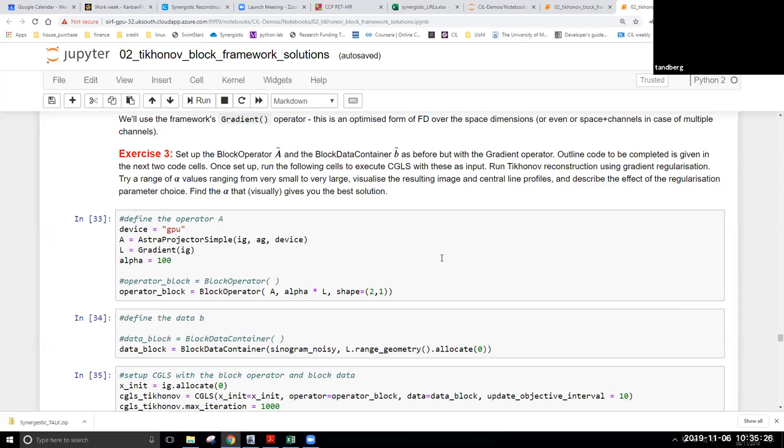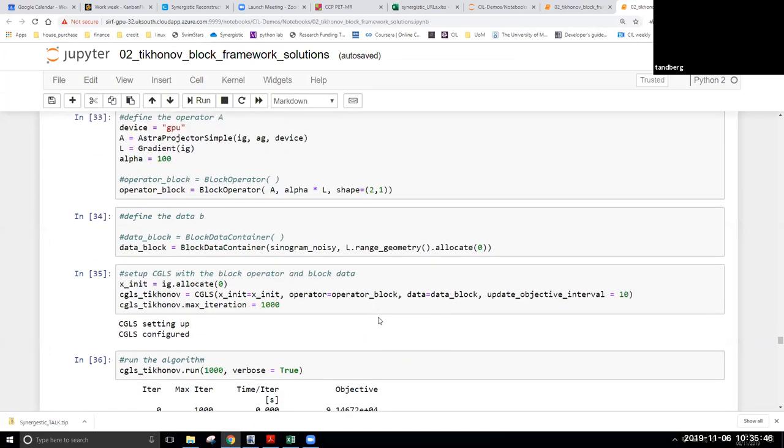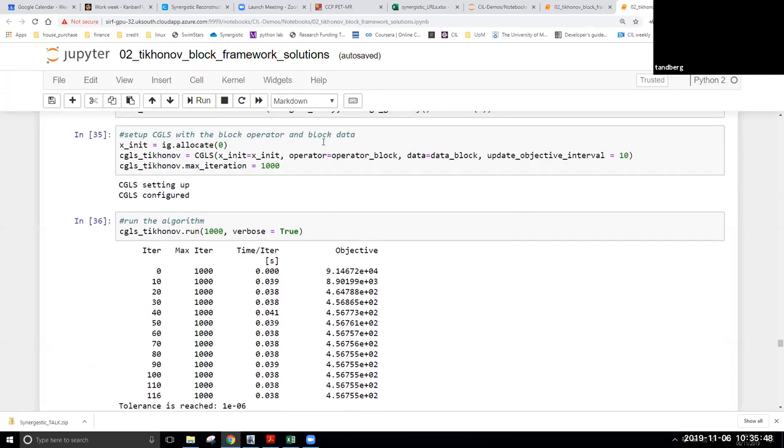We need to use our block framework, so we need to set up our block operator here, combining our A, and we can see we can multiply, apply a scalar onto our L operator, our gradient operator here, and similarly setting up the block data container for the right-hand side, and then carry on just feeding that, the block versions, into that same CGLS algorithm we were using before.